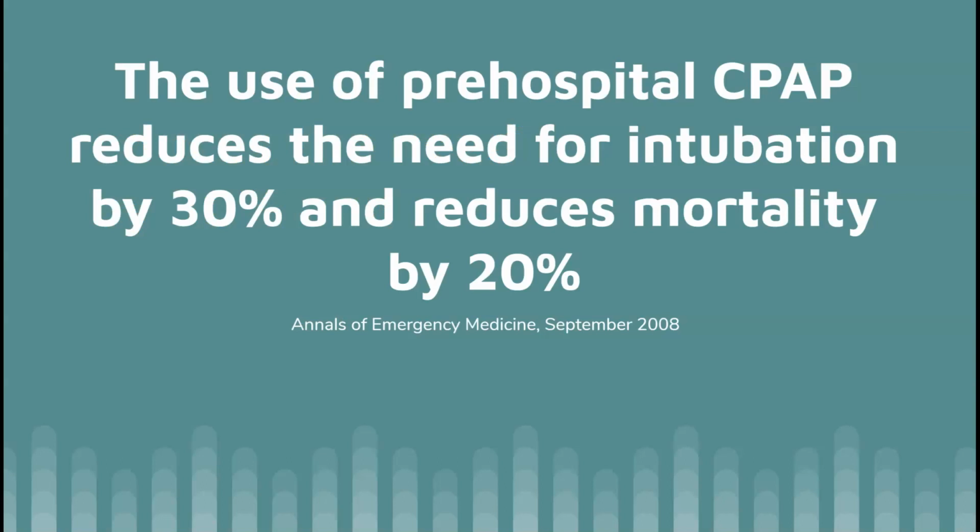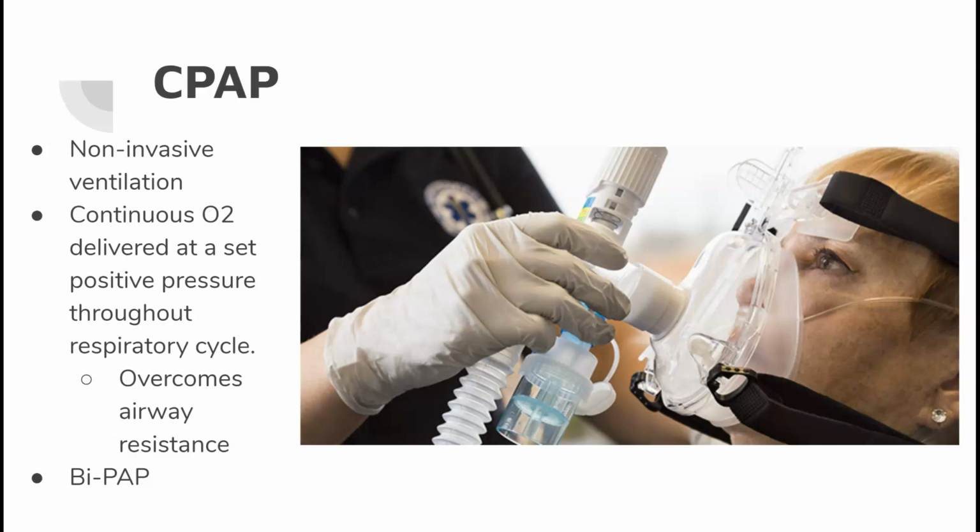So a study in 2008 found that pre-hospital CPAP reduced the need for intubation by about 30% and reduced patient mortality by about 20%. It's very effective. Yes, there are definitely some patients who either cannot tolerate it or really do need to be intubated. But those are really significant numbers in the medical community. It's highly effective for non-invasive management of a lot of different respiratory issues.